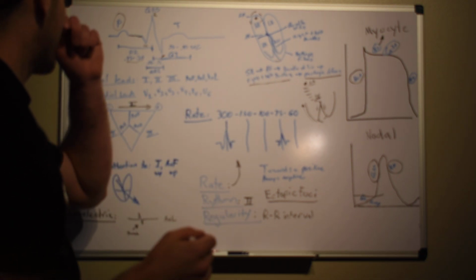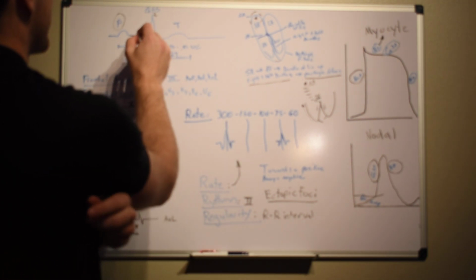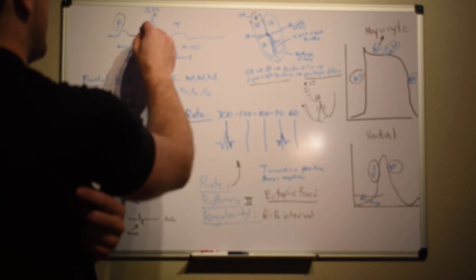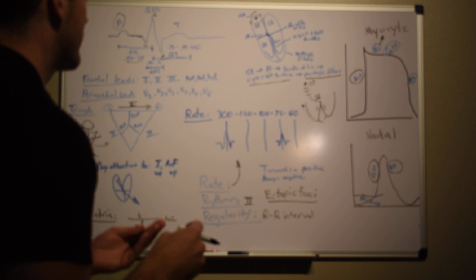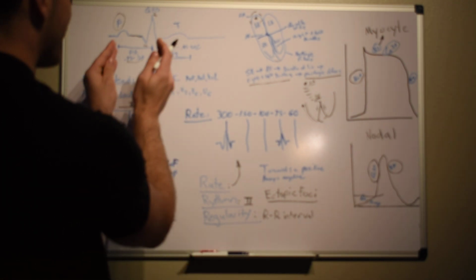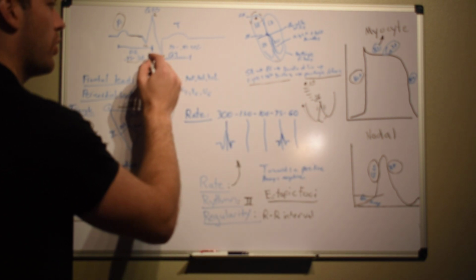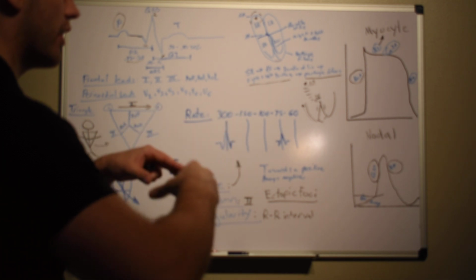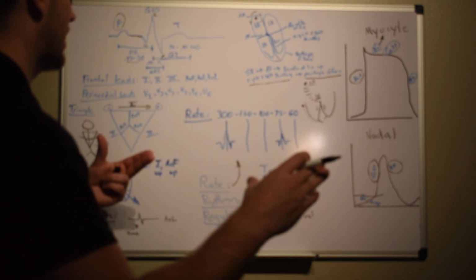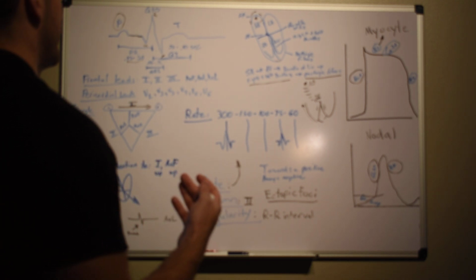And that makes sense when you think about it, because look at what this looks like. We've got a deflection this way, and then up, and then this way. It looks kind of bifurcated, just like our bundle branches. That's because it's our depolarization of the bundle branches and the Purkinje fibers, which allows us to contract our ventricles, okay?